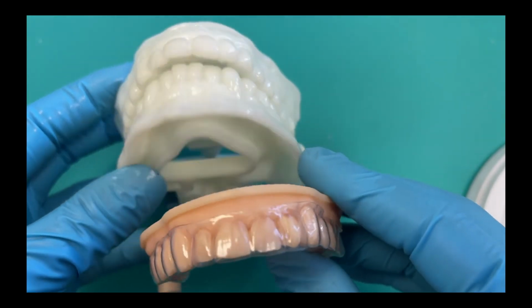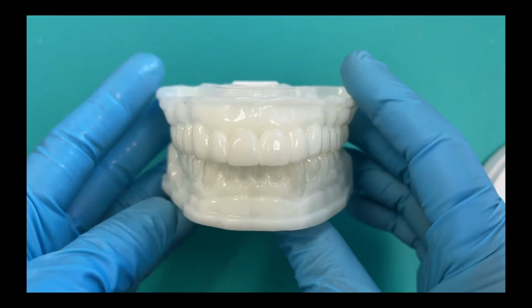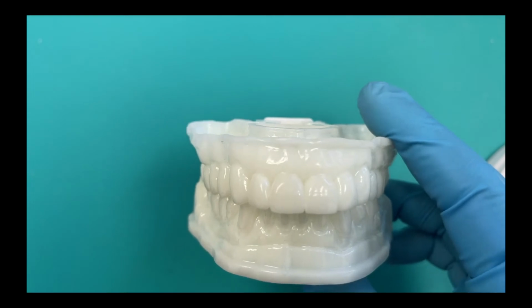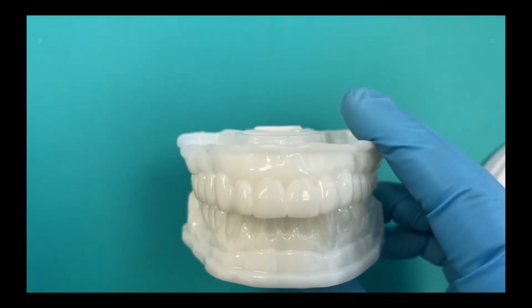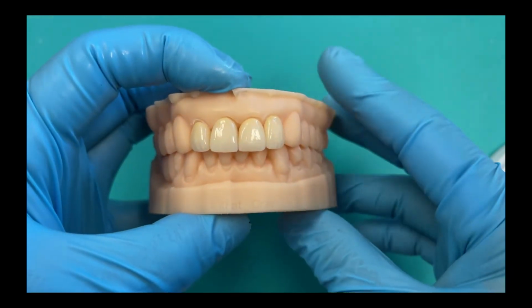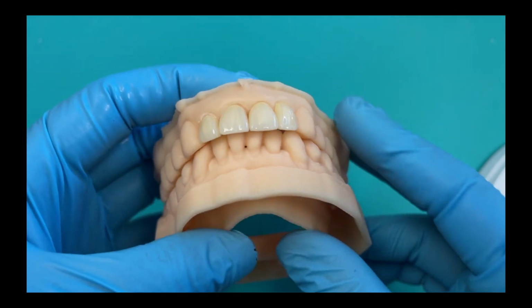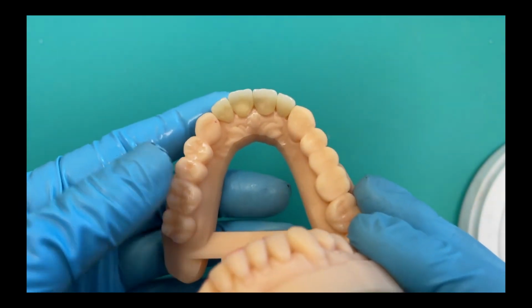So the patient went home, and of course his wife said, yes, please go forward with the treatment. And so this is a good example of how that stent can be very effective when you're putting it in the patient's mouth so they can see what the final restorations are going to actually look like. And here are the final restorations on the working model.